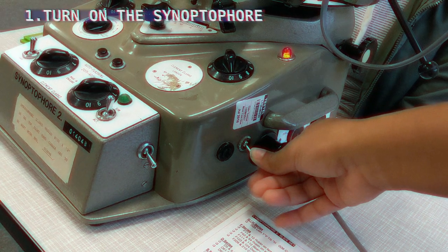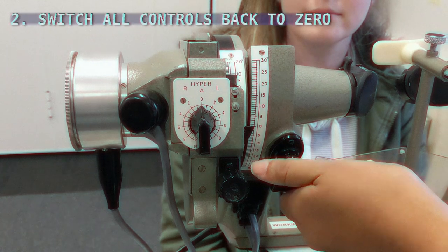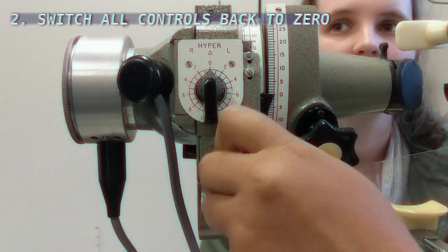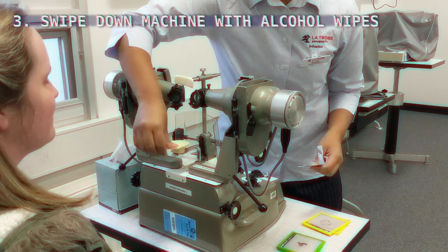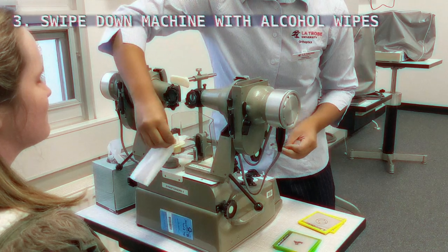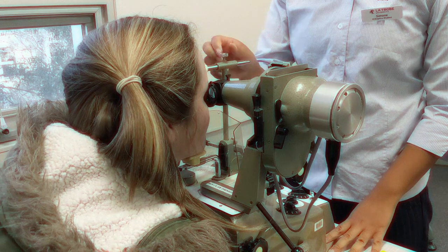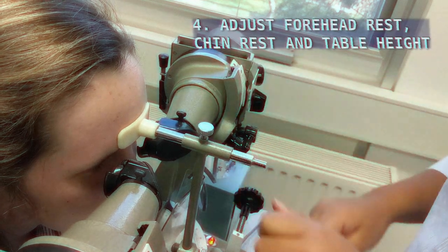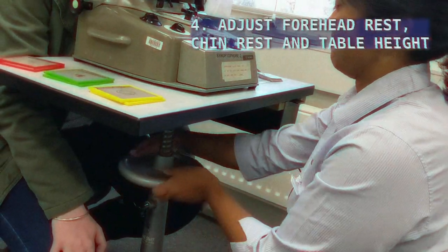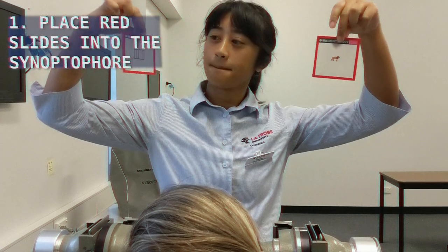Turn on the machine to illuminate the slides in the tubes, and switch all dials for both eyes to zero. Wipe down the machine for the patient, then get them to place their chin on the chin rest and forehead on the forehead rest. Ensure you have a stable view of the patient's eyes and that they are directly looking into the tubes. Adjust the table height to ensure the patient is comfortable, then insert the simultaneous perception slides into the tubes.